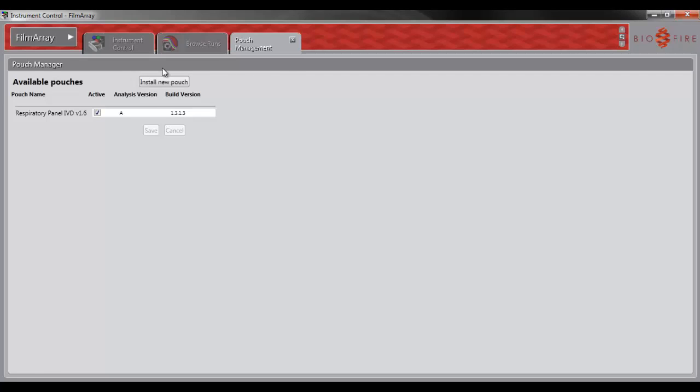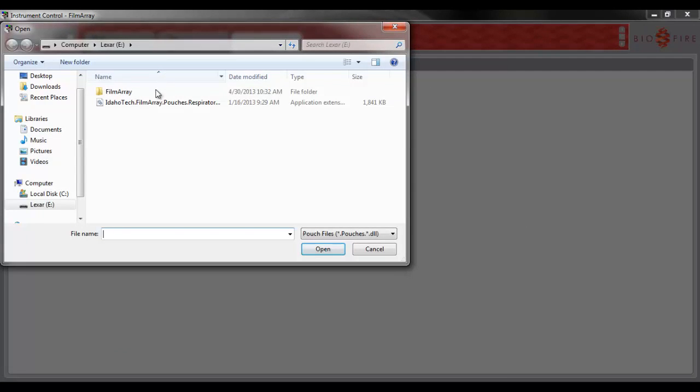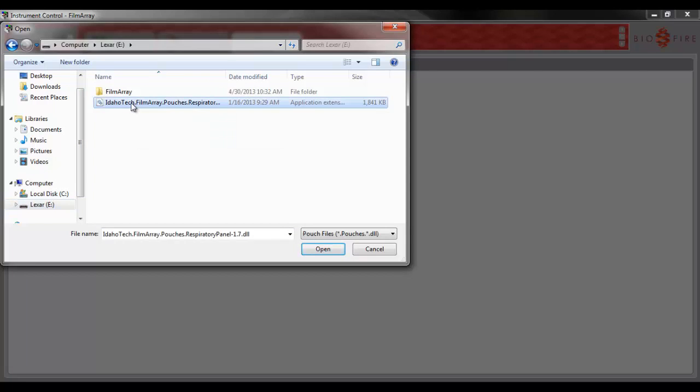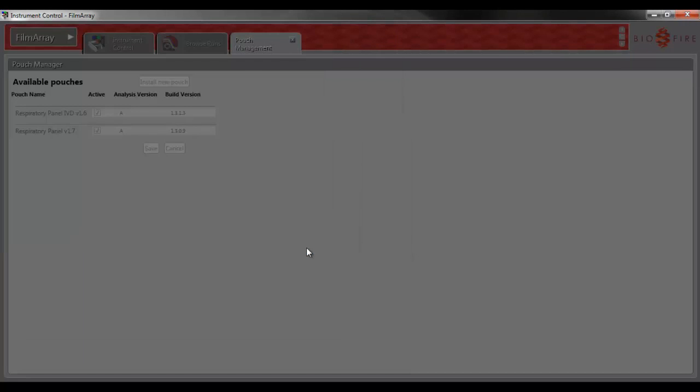Click on Install New Pouch. I found my flash drive, which is here, and then I will select the pouch module and click Open.